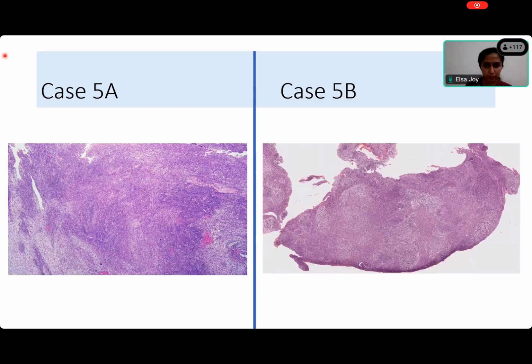Ma'am, both are cellular tumors. Very good. 5A is more basophilic. Yeah, but that's a staining issue. No? 5B is partially circumscribed. Well, we don't know. It's just a fragment of tissue, right? But they're very cellular. Yes, both of the tumors are cellular. There may be some areas where they're less cellular than in others. All right. Now that's 5A and these are 5B.